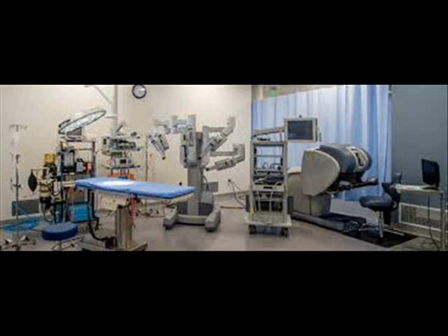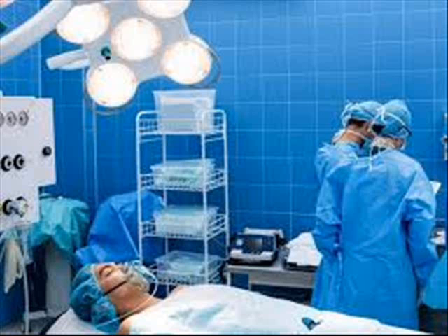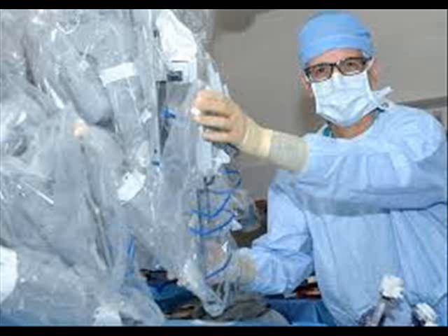Gastrointestinal surgery. Multiple types of procedures have been performed with either the Zeus or Da Vinci robot systems, including bariatric surgery and gastrectomy for cancer. Surgeons at various universities initially published case series demonstrating different techniques and the feasibility of GI surgery using the robotic devices. Specific procedures have been more fully evaluated, specifically esophageal fundoplication for the treatment of gastroesophageal reflux and Heller myotomy for the treatment of achalasia. Other gastrointestinal procedures including colon resection, pancreatectomy, esophagectomy and robotic approaches to pelvic disease have also been reported.